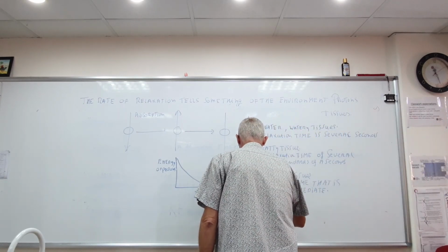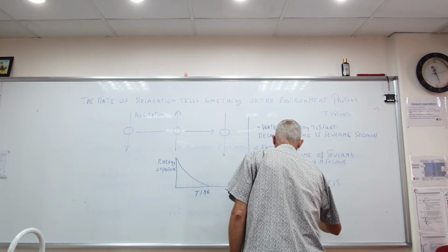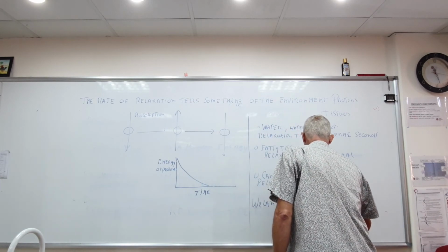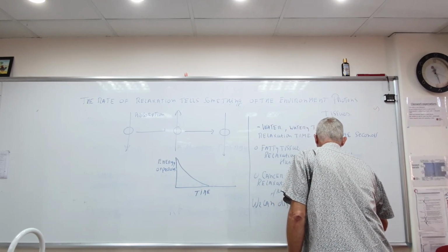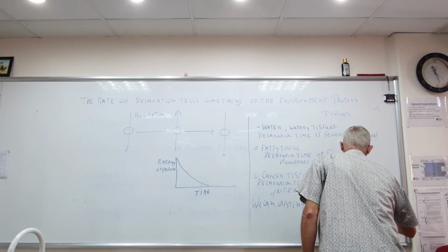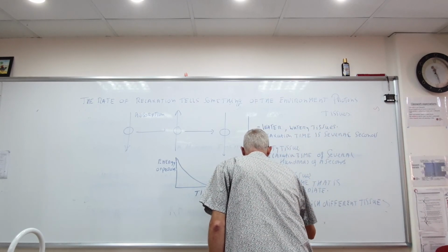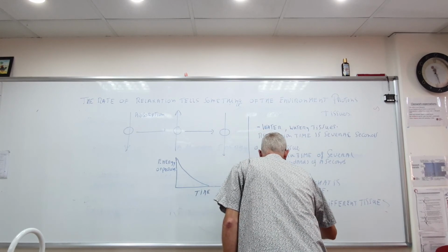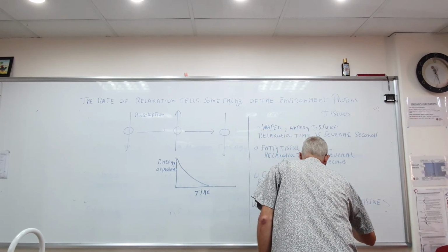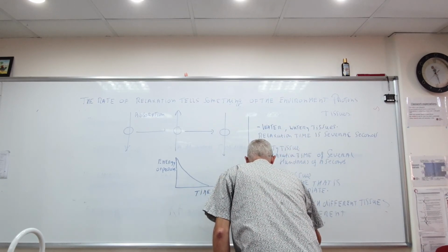So, we can distinguish different tissues according to different relaxation times.